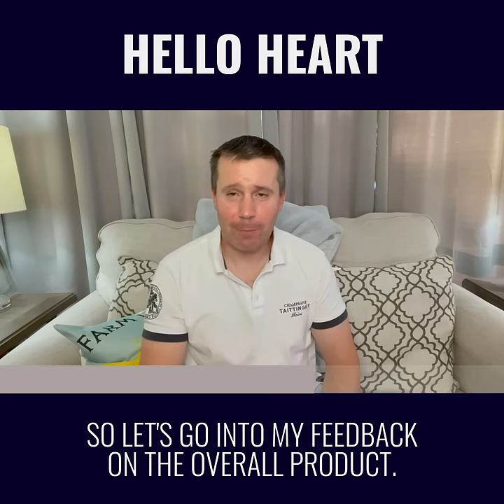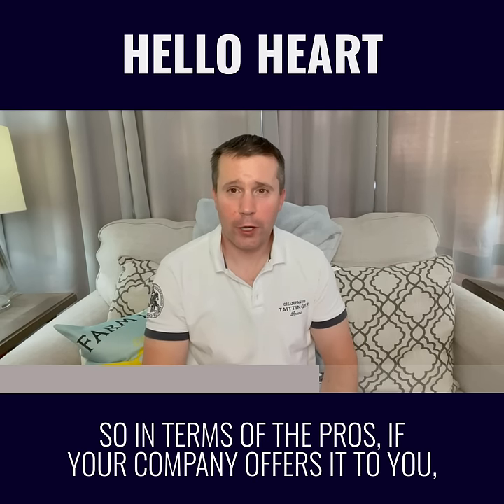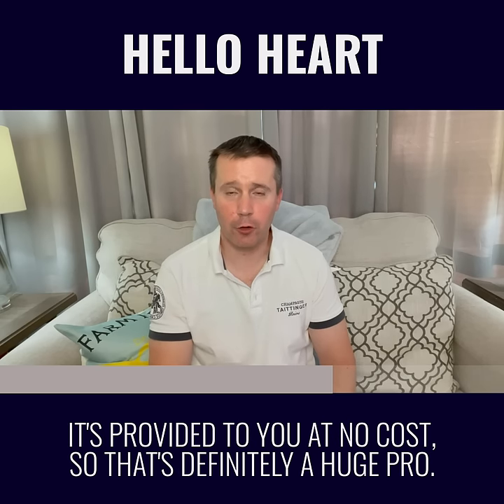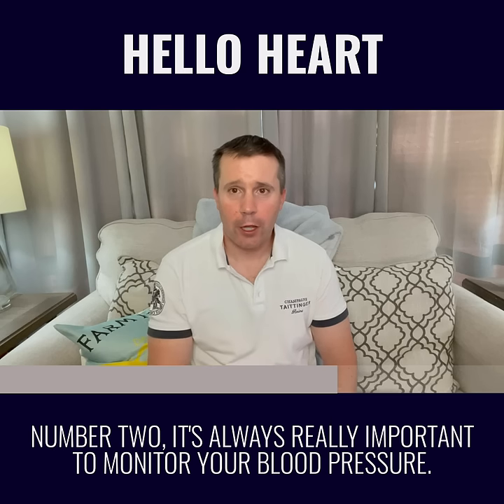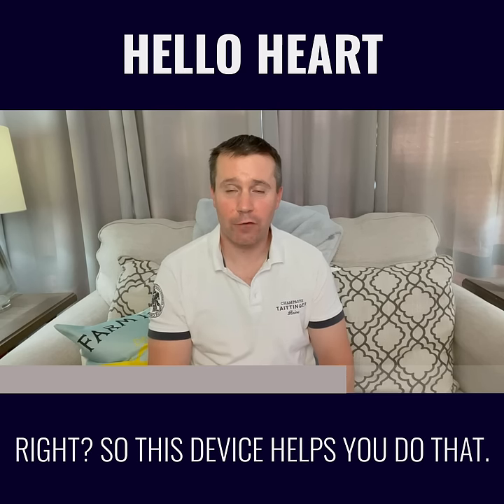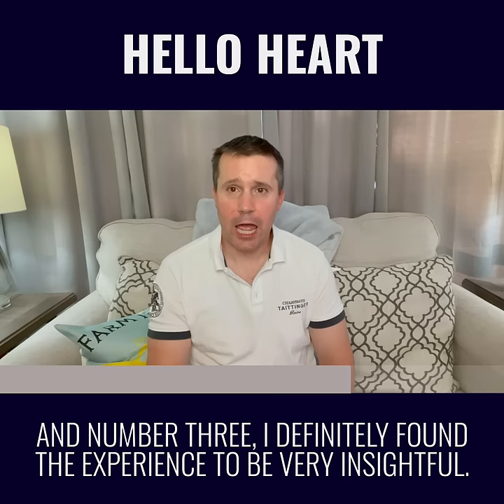So let's go into my feedback on the overall product. In terms of the pros: number one, if your company offers it to you, it's provided at no cost, so that's definitely a huge pro. Number two, it's always really important to monitor your blood pressure, and this device helps you do that. And number three, I definitely found the experience to be very insightful.